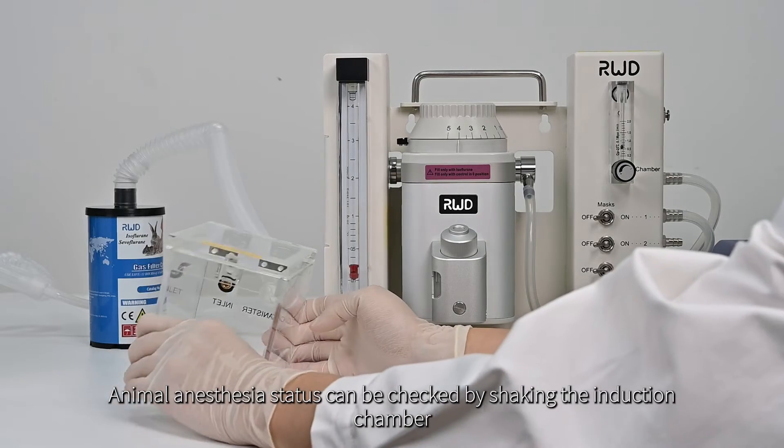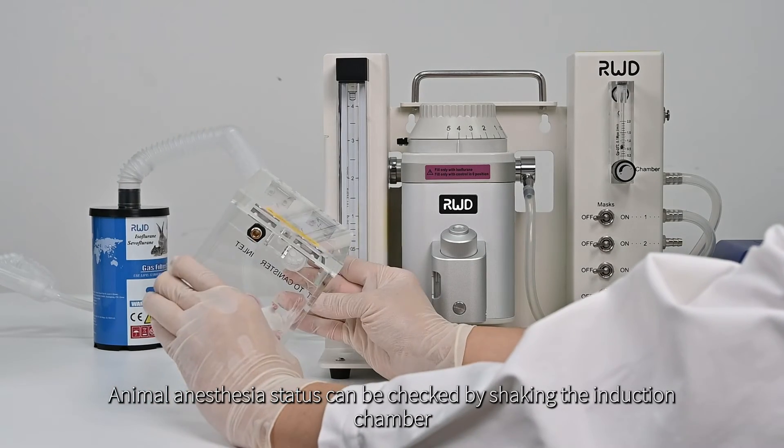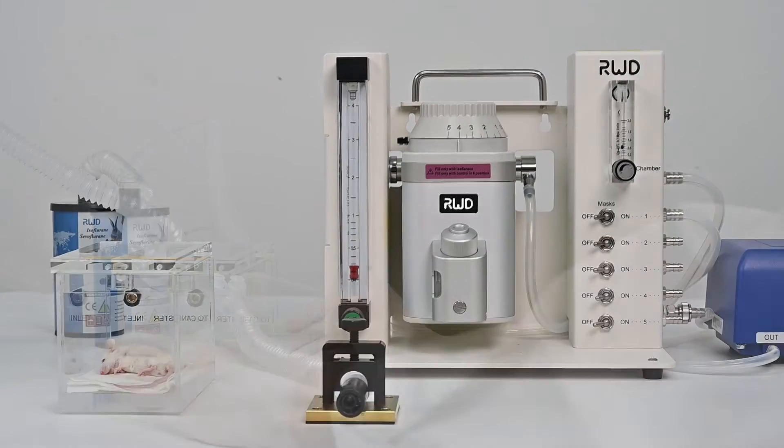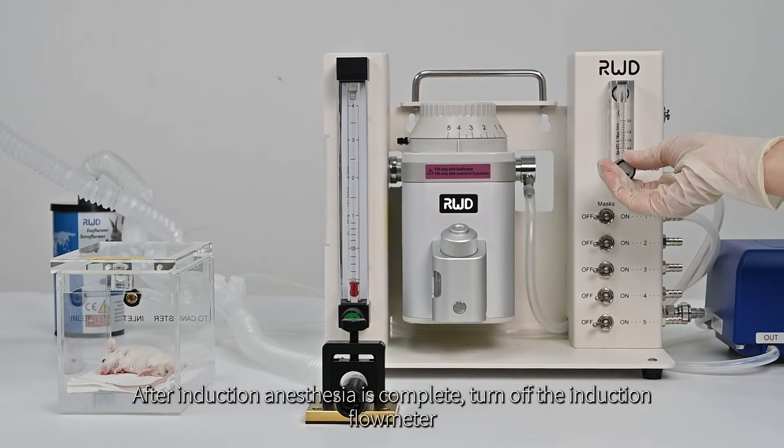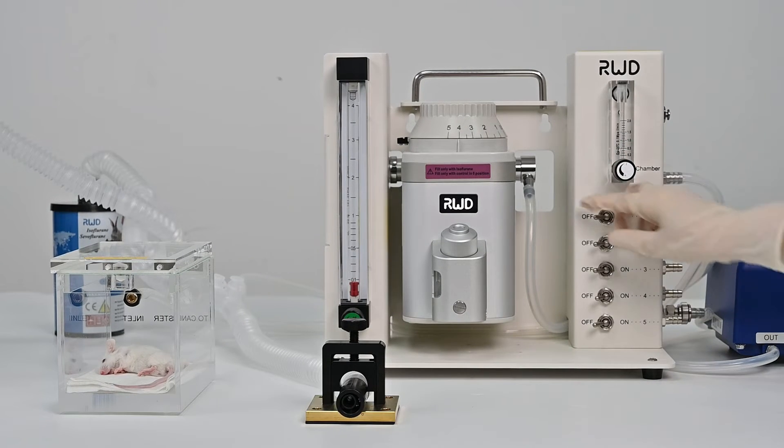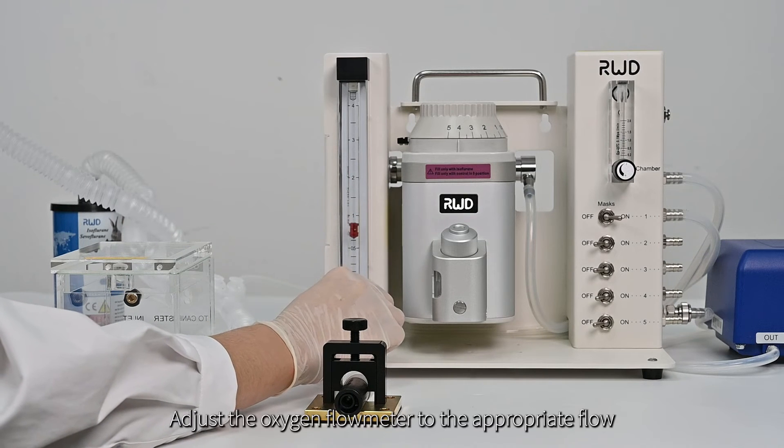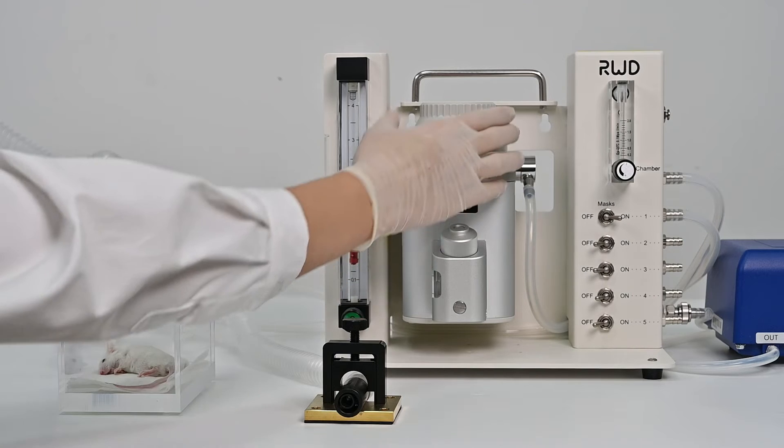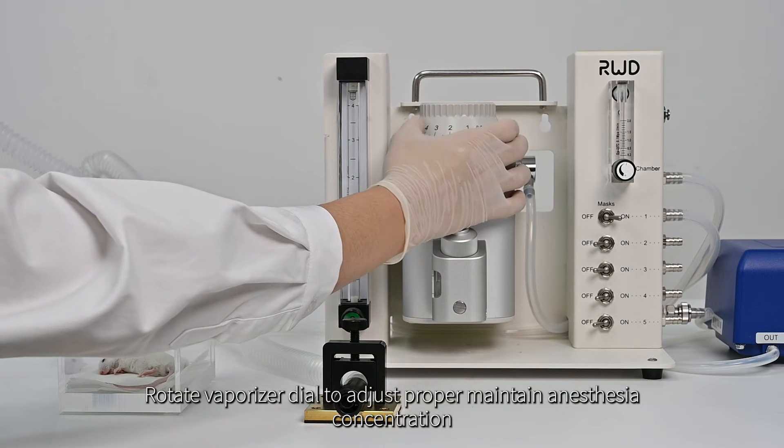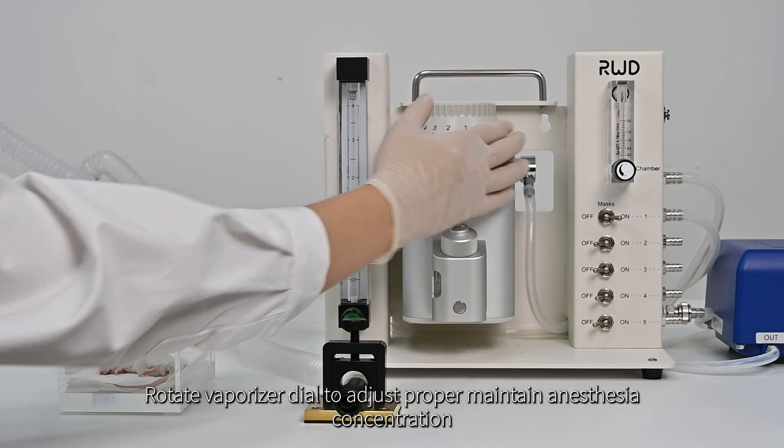Animal anesthesia status can be checked by shaking the induction chamber. After induction anesthesia is complete, turn off the induction flow meter. Open the necessary channel switch. Adjust the oxygen flow meter to the appropriate flow. Rotate vaporizer dial to adjust proper maintain anesthesia concentration.